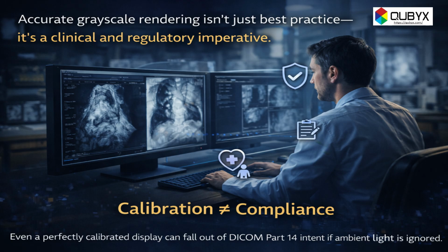This is not just a technical issue. DICOM Part 14 underpins diagnostic consistency, quality assurance, and regulatory compliance. In teleradiology, display inaccuracies can compromise diagnostic confidence and weaken medico-legal defensibility. If grayscale accuracy cannot be demonstrated, image interpretation becomes harder to defend.